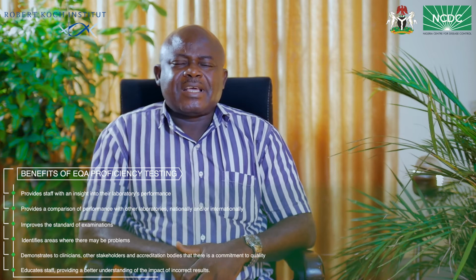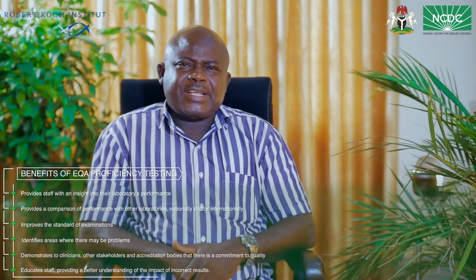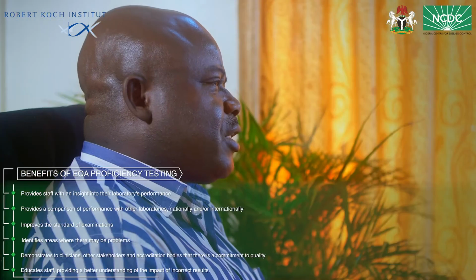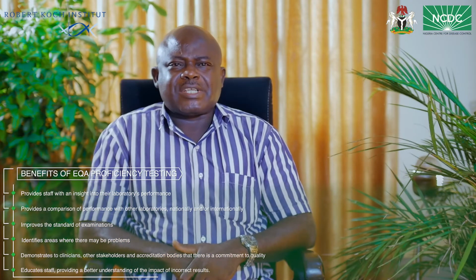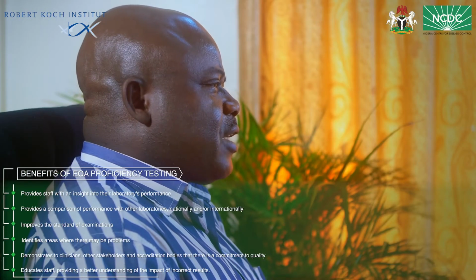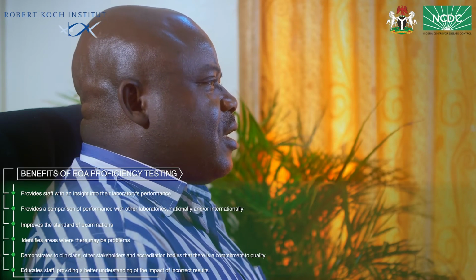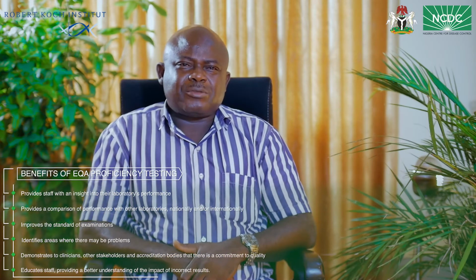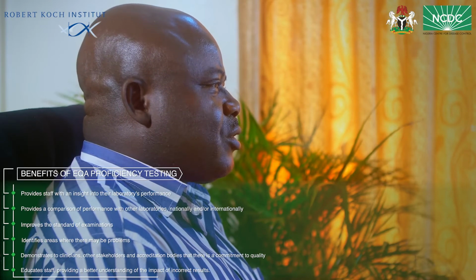The benefit of external quality assurance proficiency testing is to provide staff with an insight into their laboratory performance, provide a comparison of performance with other laboratories nationally and internationally, improve the standard of examination, identify areas where there may be problems, and demonstrate to clinicians, other stakeholders, and accreditation bodies that there is a commitment to quality. It also benefits by educating the staff, providing a better understanding of the impact of incorrect results.